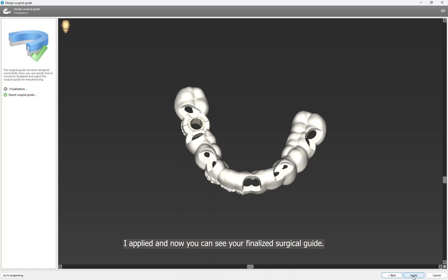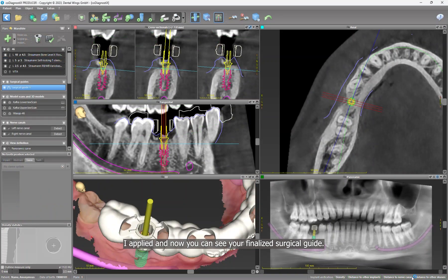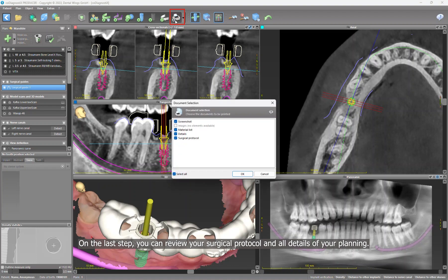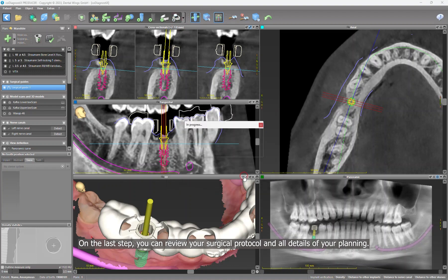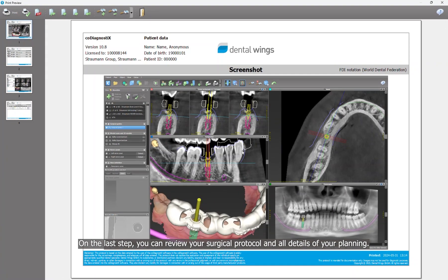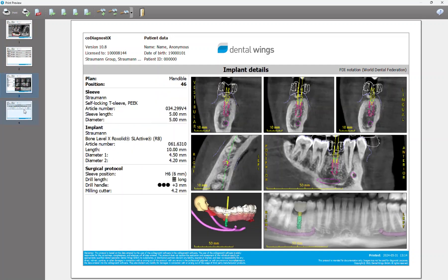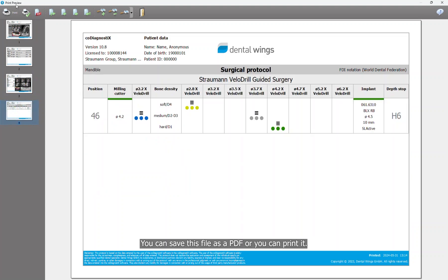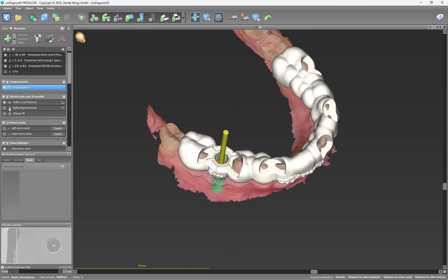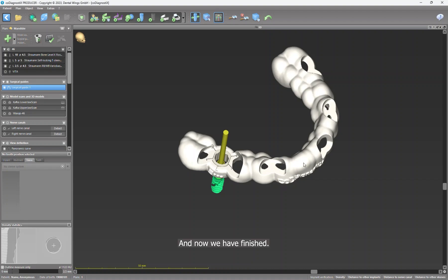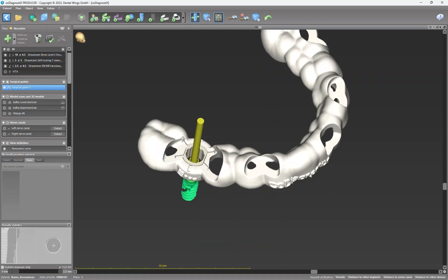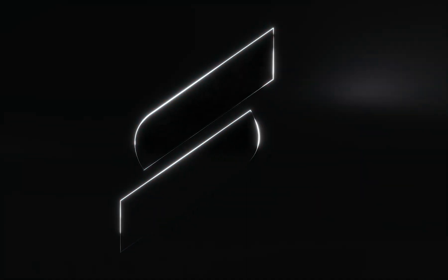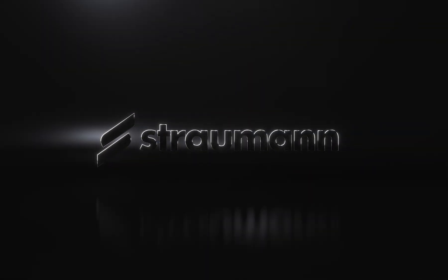I apply it, and now you can see your finalized surgical guide. On the last step, you can review your surgical protocol and all details of your planning. You can save this file as PDF or you can print it. And now we are finished.